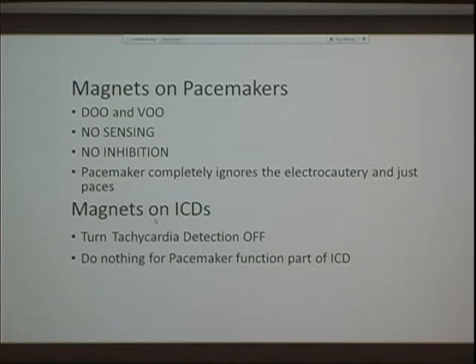They do not affect the pacemaker function, which means if you have noise externally in a patient with a defibrillator, the defibrillator will not shock for noise, but it might not pace either, because it does not affect the pacemaker function, and that noise may be viewed as intrinsic activity, and the pacemaker portion will not work. So magnets on defibrillators do not affect the pacemaker function of the defibrillator. Hence, you will need to reprogram these patients who are pacemaker dependent but have defibrillators.